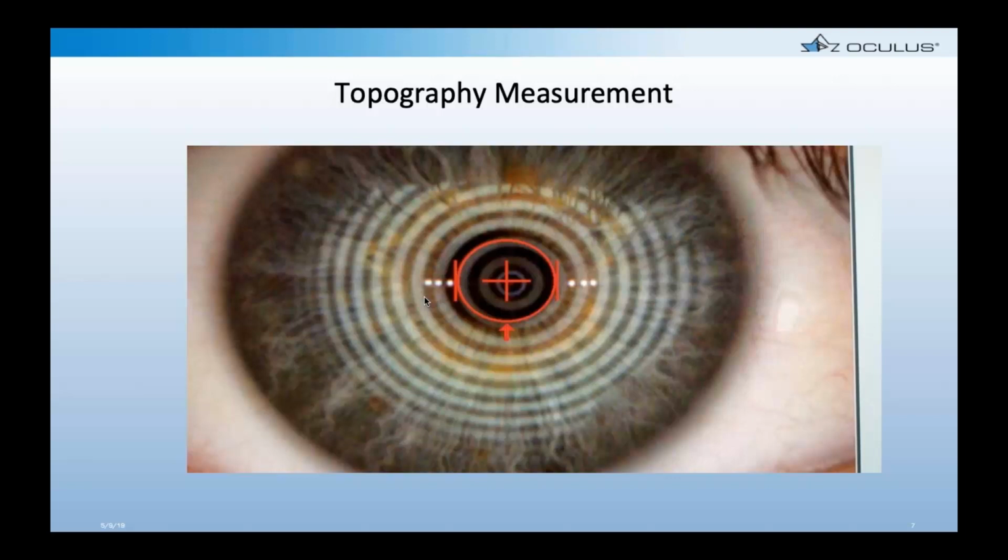So it's not a stretch to say that from a patient perspective, to walk them into the room where the keratograph is and to be walking out with keratometric data and corneal shape and size information, it takes about 1 minute. And again, that's including 20 seconds of that time for typing in the patient's name and date of birth. So it's extremely quick.